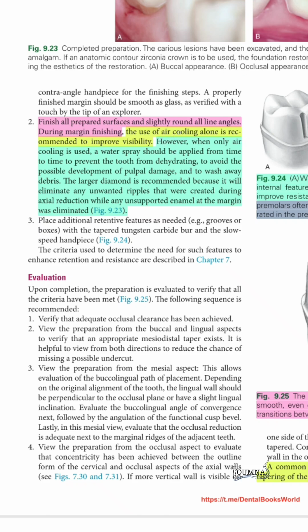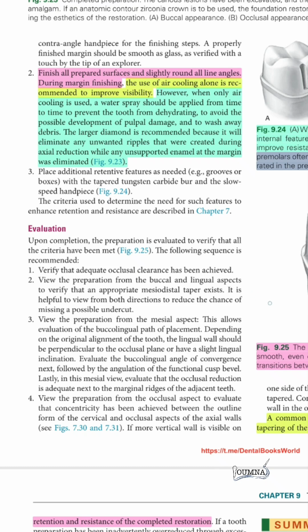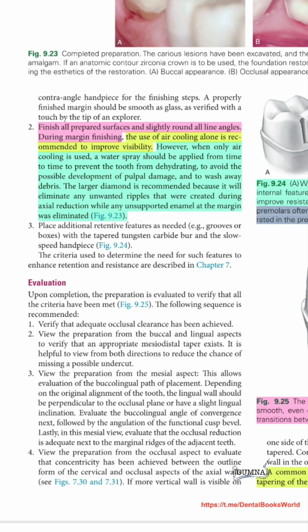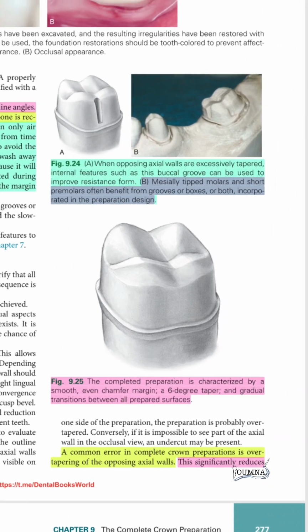We can use only air cooling to improve the visibility, using a water spray from time to time to prevent dehydration, to avoid possible pulpal damage, and to wash away the debris. The larger red finishing diamond is recommended because it will eliminate any unwanted ripples and will remove any unsupported enamel at the margin of the teeth.